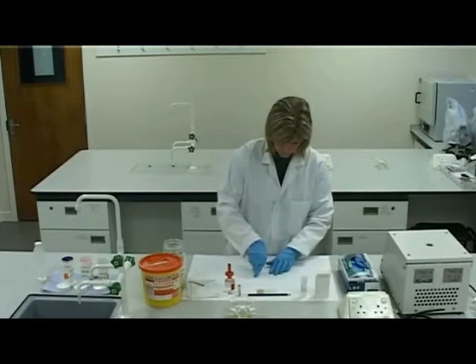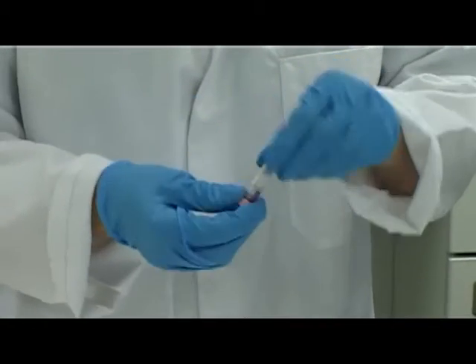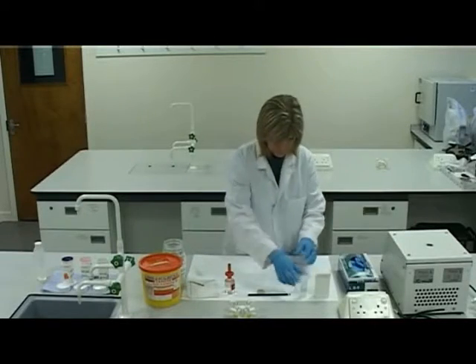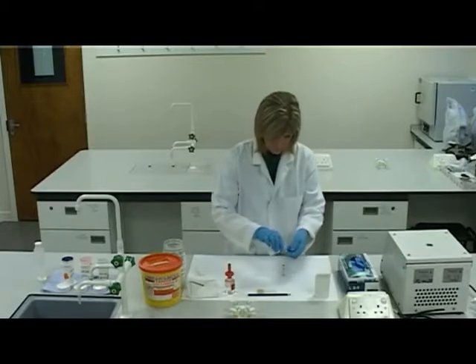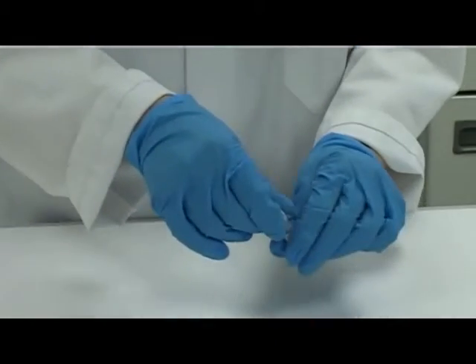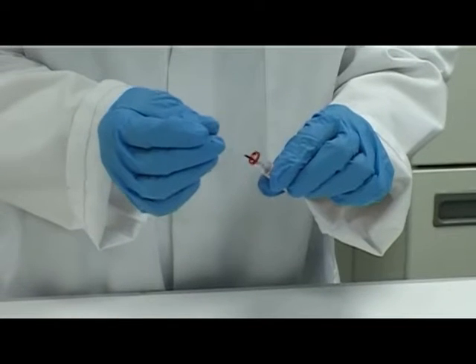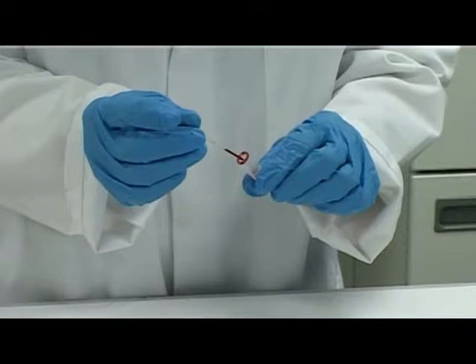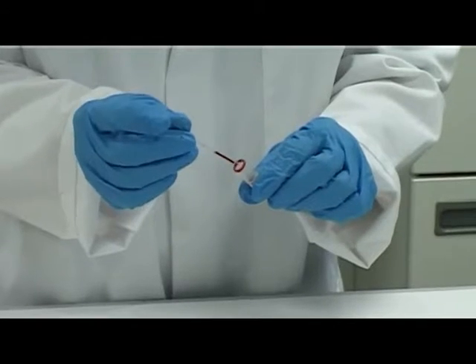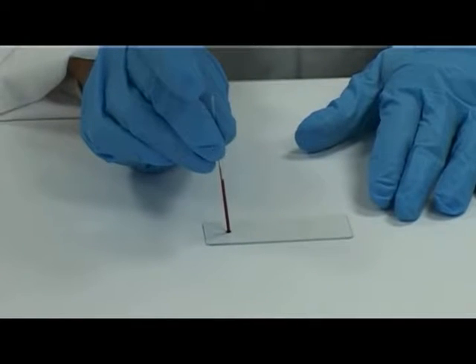Select an EDTA sample and gently mix the sample. Select a plain capillary tube. Insert the tube into the blood sample and draw up a small amount of blood. Place a finger over the top of the tube or keep the tube horizontal to prevent leakage, then remove the tube from the sample. Dot a small amount of blood near one end of the slide.